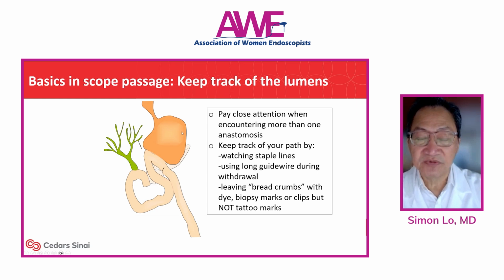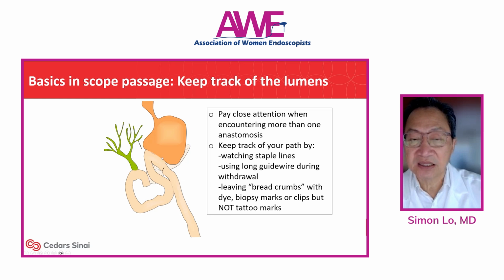And also, some of these anatomies, especially Billroth II or Whipple, have additional lumens to bypass the afferent and efferent limbs, called the Braun procedure, that allow additional permutations of passing the scope to different lumens, different ways of passage. So you have to be able to keep track of where you're going.